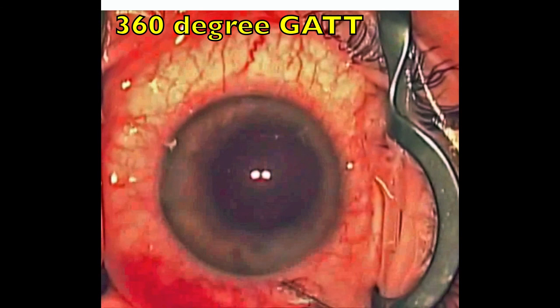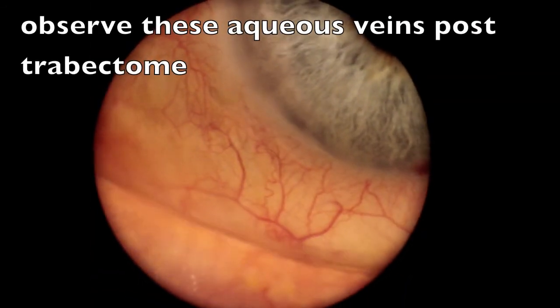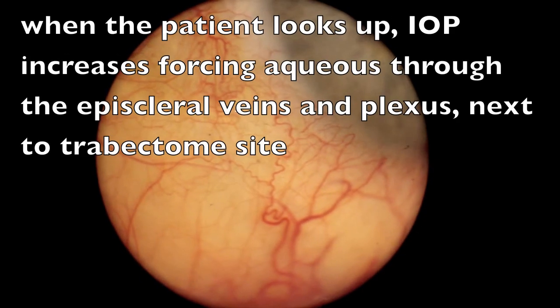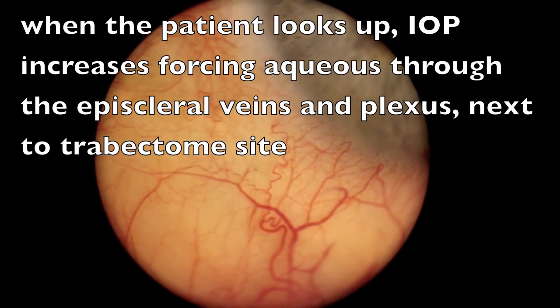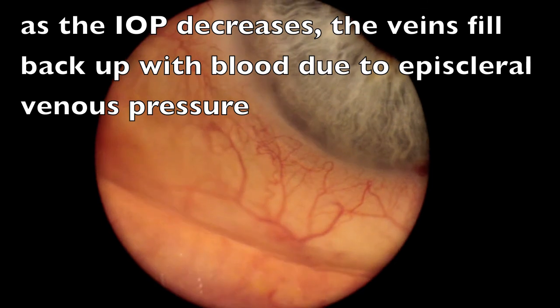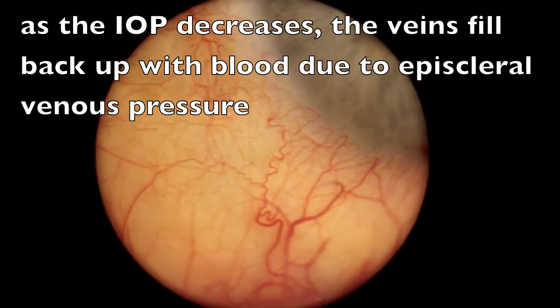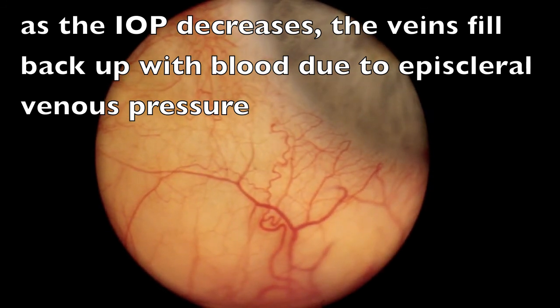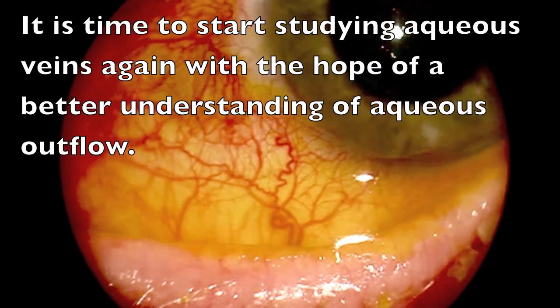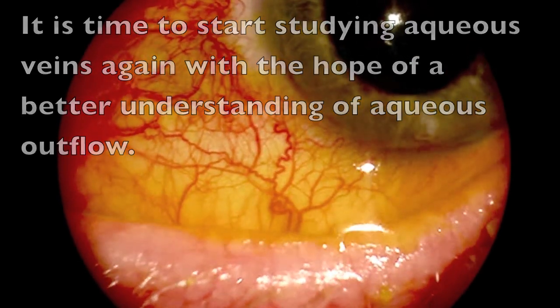Again, the 360-degree GATT procedure with the blanching in comparison to the eye stent. Observe these aqueous veins post-trabectome. When the patient looks up, intraocular pressure increases, forcing aqueous through the episcleral veins and plexus next to the trabectome site. As the pressure decreases, the veins fill back up with blood due to episclerovenous pressure. It is time to start studying aqueous veins again with the hope of a better understanding of aqueous outflow.